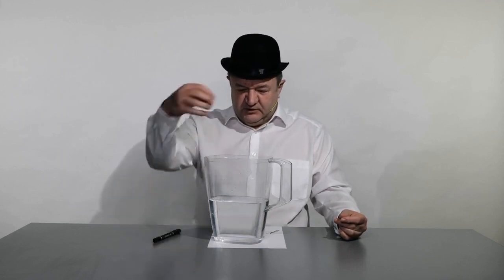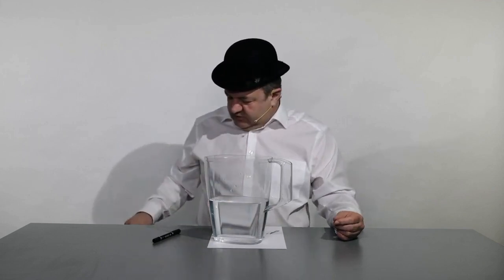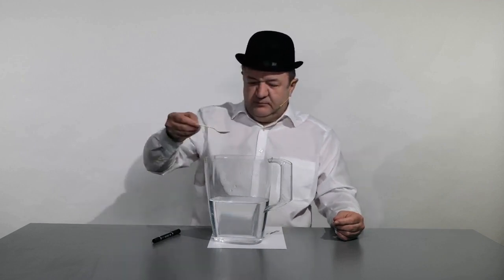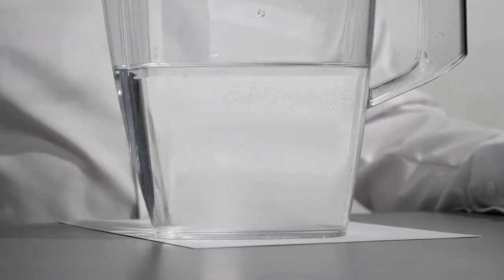If we imagine that there is an X-ray lamp above, and below is the paper, which is photographic, or today, in a digital system, some sensor that receives those rays. So I will show you how the examination is performed. Radiological, for example, mammography. Notice those salt crystals that are falling at different times to the very bottom.